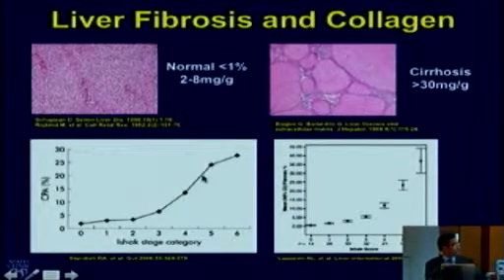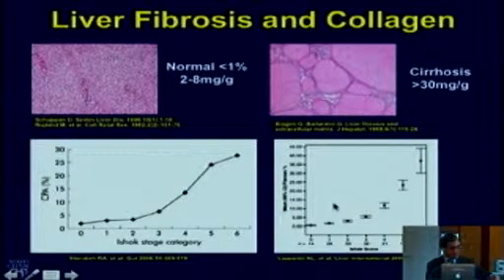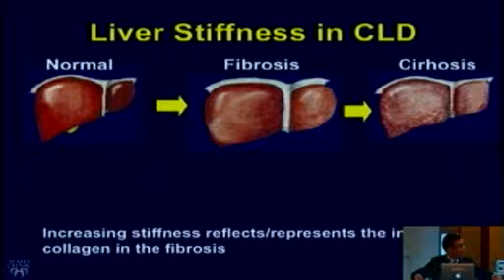So any technique is good for differentiating advanced fibrosis from early fibrosis, but it is difficult to differentiate between early stages of fibrosis. And this has been echoed in many different studies. And we know that the normal liver is very soft. Most of the surgeons who are sitting over here know how a normal organ feels and how a cirrhotic liver feels at laparoscopy or laparotomy.